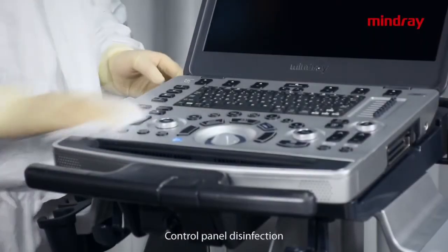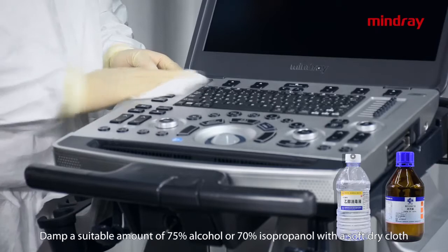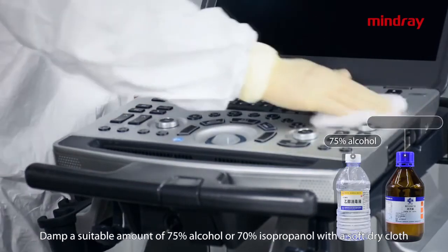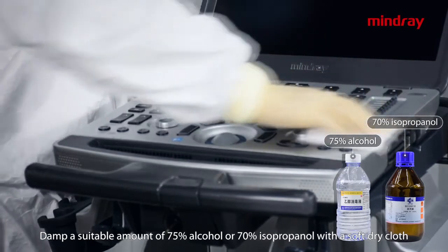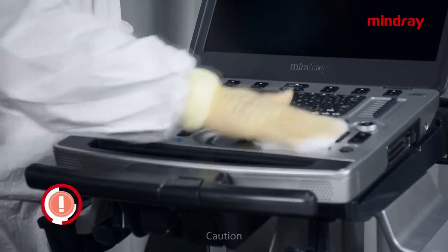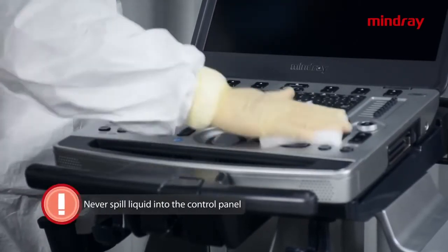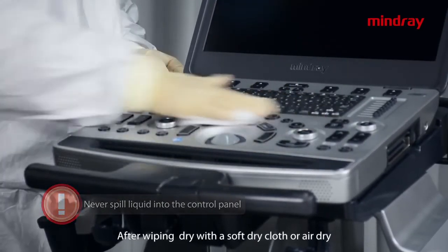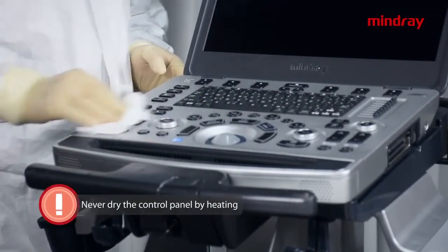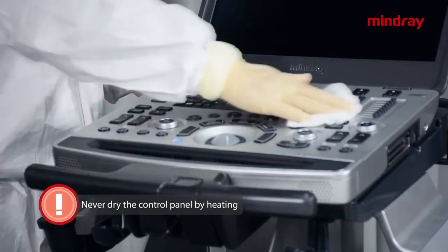Control panel disinfection. Dampen a soft dry cloth with a suitable amount of 75% alcohol or 70% isopropanol. Wipe the control panel for disinfection. Caution: never spill liquid into the control panel. After wiping, dry with a soft dry cloth or air dry. Never dry the control panel by heating.